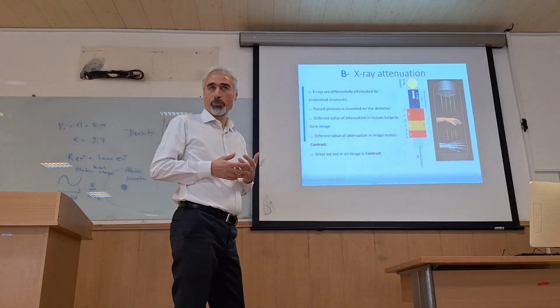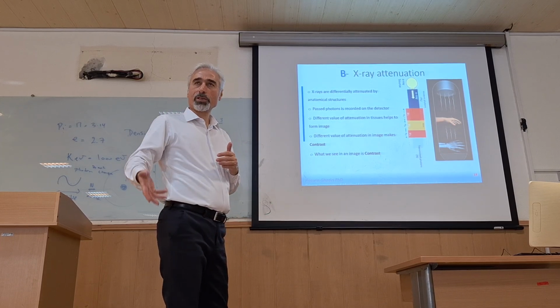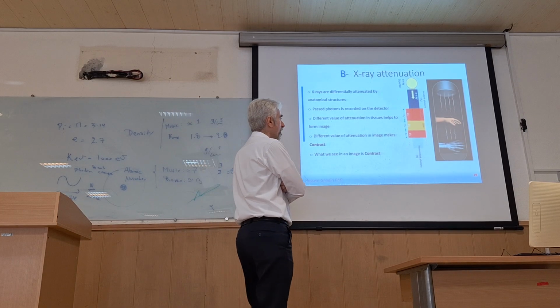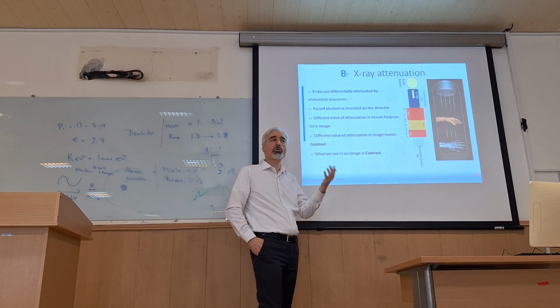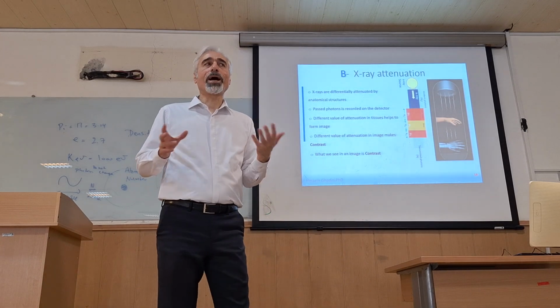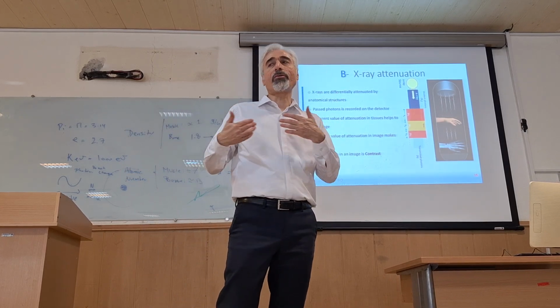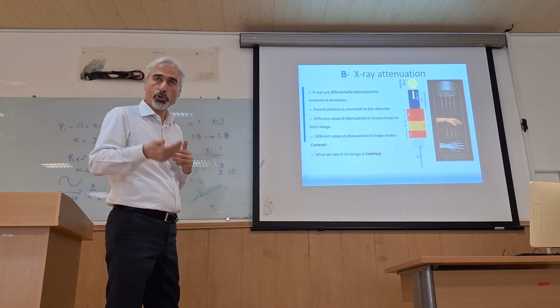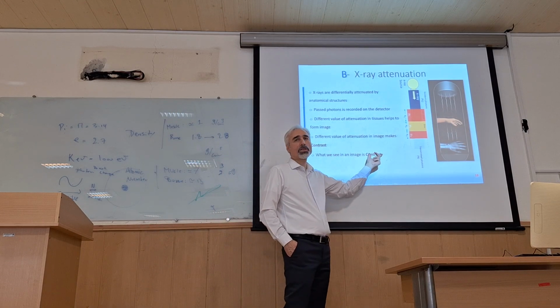The X-ray image is a shadow because it's formed by different transmission of the photons at different points. And it makes the image, and as I said, we call the image contrast, because image means contrast, or contrast means image. These two terms are somehow equal. Everywhere you have contrast or differences in colors, you have an image, and everywhere you have an image, you can see different colors or contrast in colors inside the image. So what we see in an image is contrast.